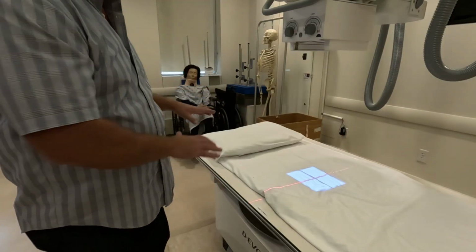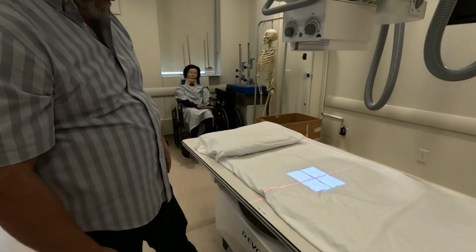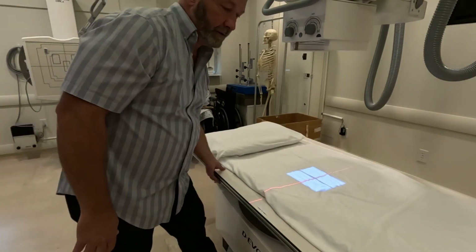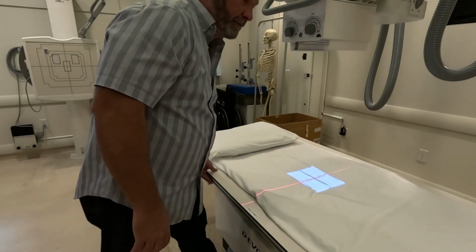What you want to do is move the patient throughout. So now that those two are lined up, and this is probably the thing that you're going to struggle with the most, once those two are lined up, you can push the button on the table and you can move the patient throughout the light field and radiation field.